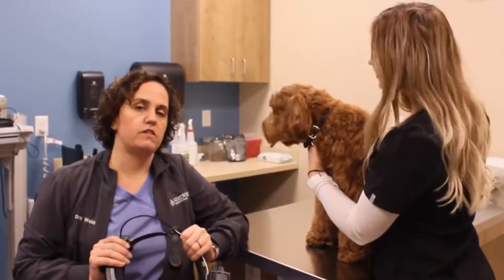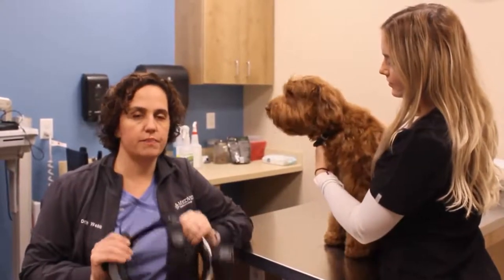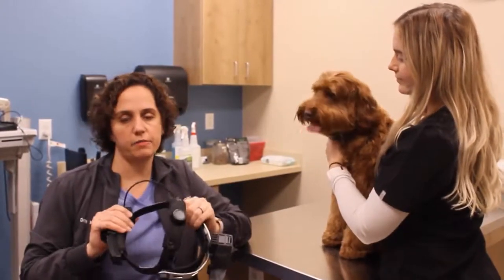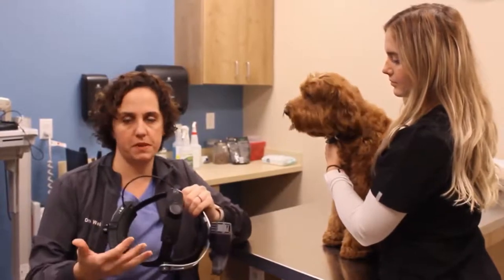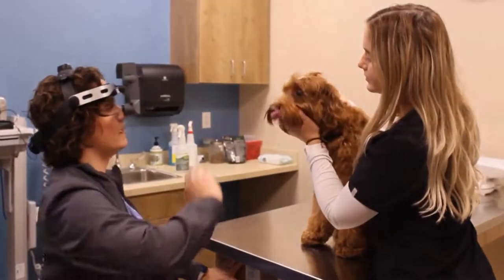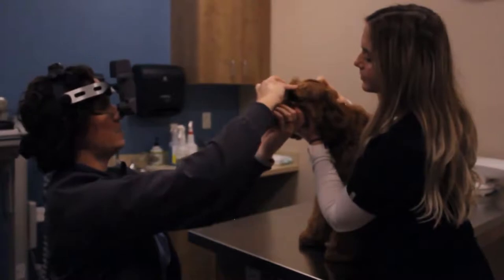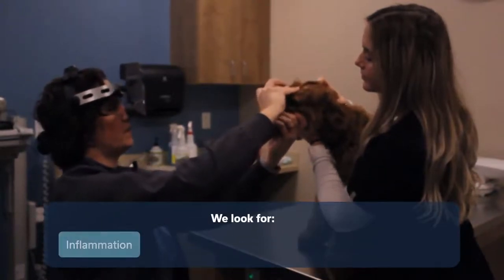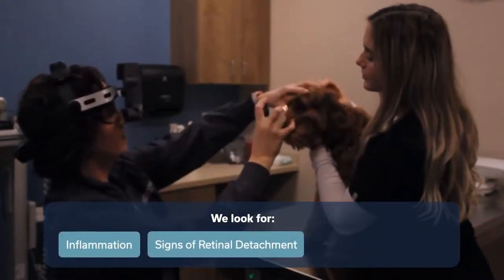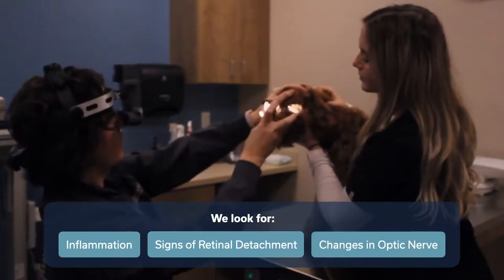The last thing we're going to do is look at his retina and the optic nerve — the structures in the back of the eye. This is a headset that allows me to have both of my hands free but gives me light to look inside with different lenses. We'll turn the light down again and I'm able to look at his retina for inflammation, signs of retinal detachment, and changes in his optic nerve in both eyes.